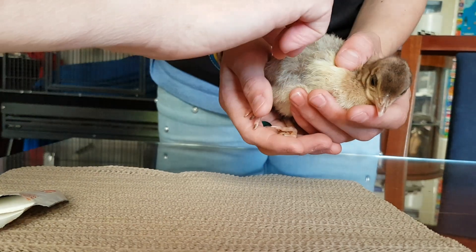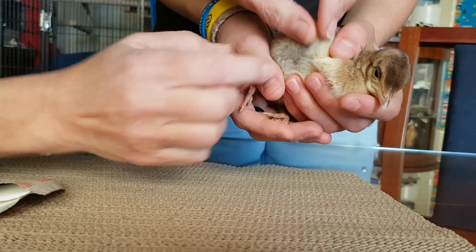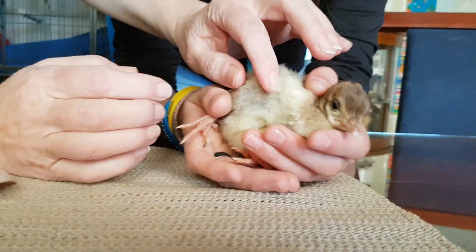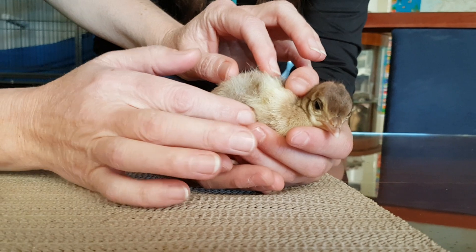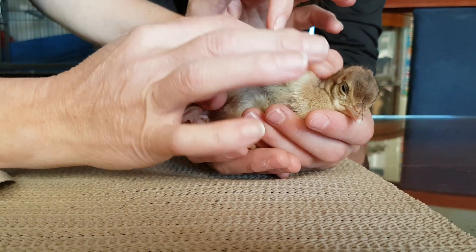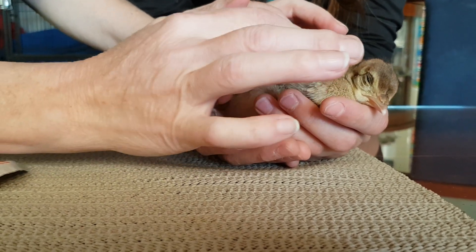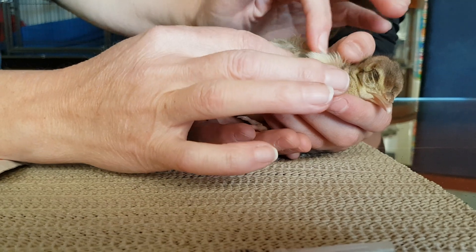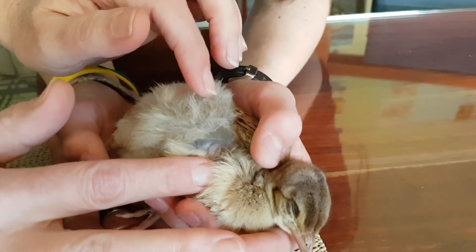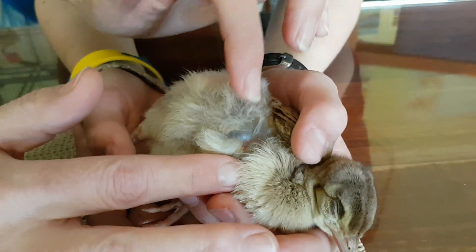Whereabouts are you going to go? I'm just trying to find where it's really airy. You might want to rest your hands on the table so you can get that. I'm thinking up here — feels quite airy, actually, a bit further back here. Try here. That's a good spot. You can actually see — that's her skin stretched out.